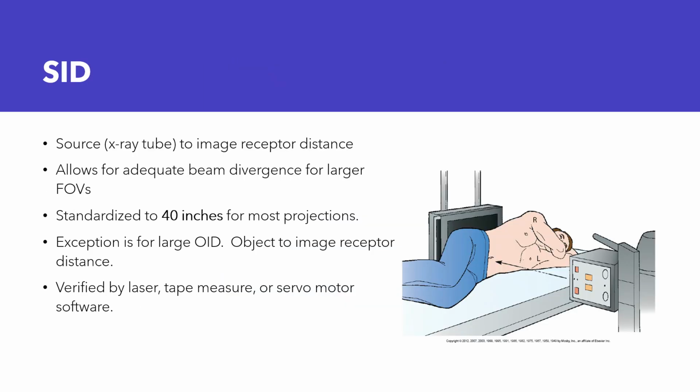All right. SID. What the heck is SID? Well, we did cover it in the chest PA and lateral lecture that you should have already listened to. Okay? But it stands for source to image receptor distance. Source of what? X radiation.